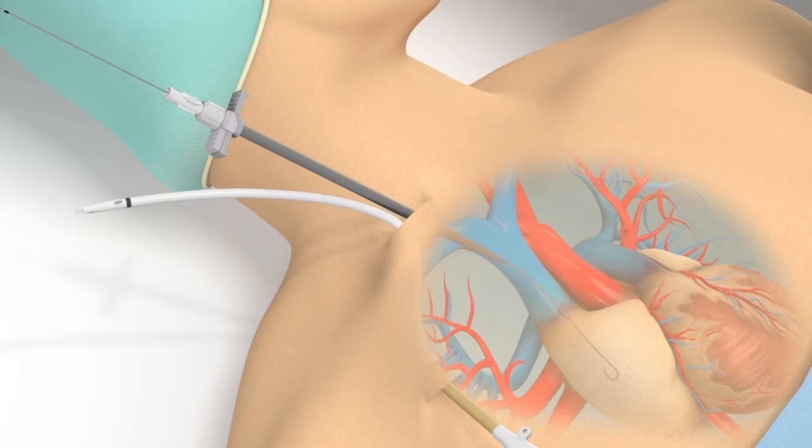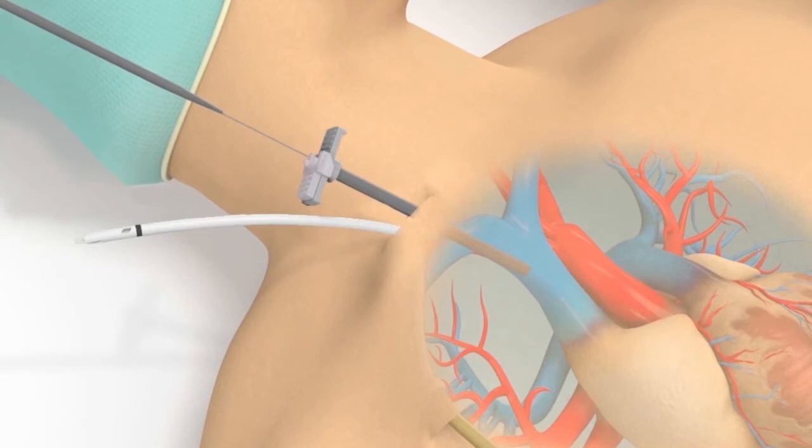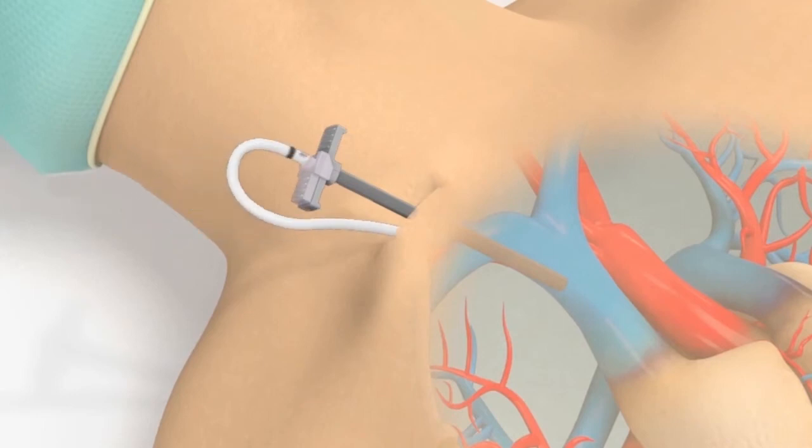While holding the sheath in place, unlock the rotation collar. Gently remove the dilator and guide wire together from the sheath. Discard the dilator and guide wire. Insert and advance the catheter quickly through the valve of the sheath. To prevent kinking the catheter, it may be necessary to advance in small steps by grasping the catheter close to the sheath while inserting. Continue inserting the catheter through the valved sheath and into the vein.